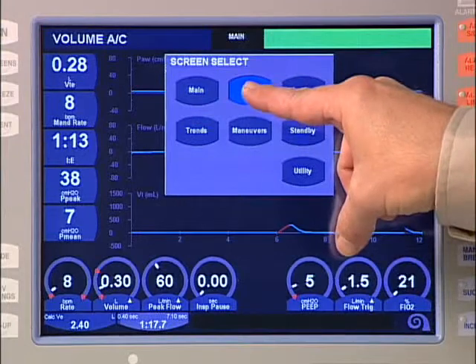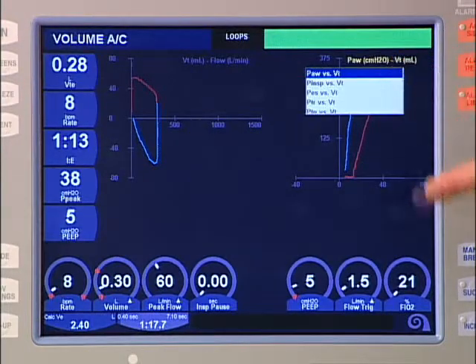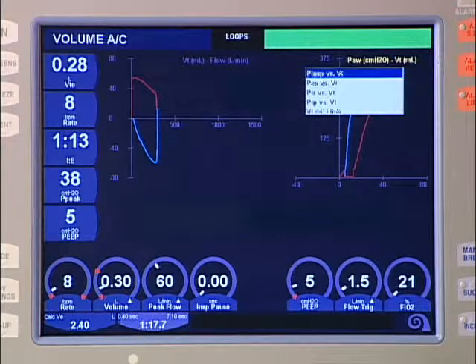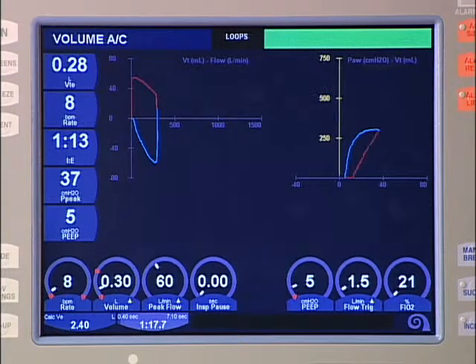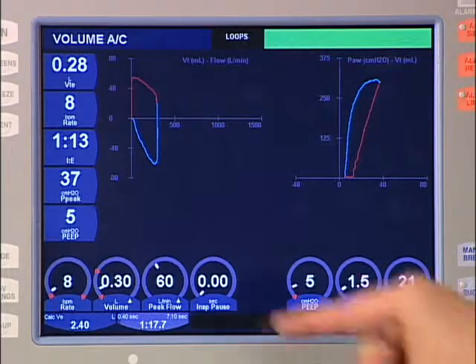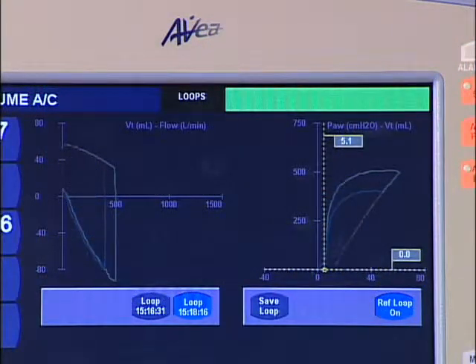Select the loop screen from the screens menu. Two real-time loops are displayed. Touching the loop title allows selection from a menu of flow volume, airway pressure volume, esophageal pressure volume, tracheal pressure volume, and transpulmonary pressure volume loops. Scaling is accomplished by touching the axis to be scaled, turning the data dial, and touching the axis a second time. Press the freeze button to activate the cursor. Press the save loop area to save a selected loop. A maximum of four loops can be saved and selected as reference images for comparison with live loops. The reference loop remains in the background under the real-time loop.